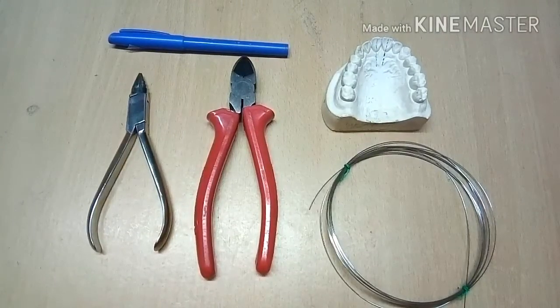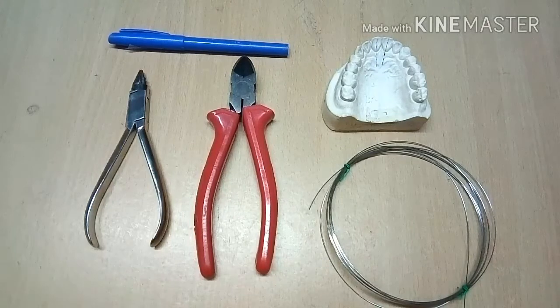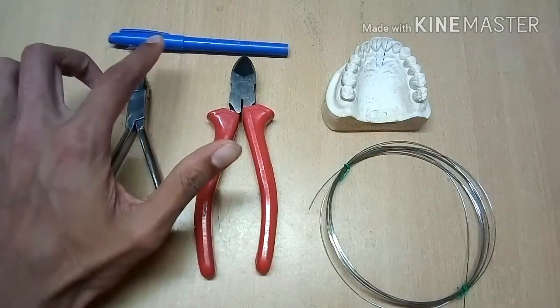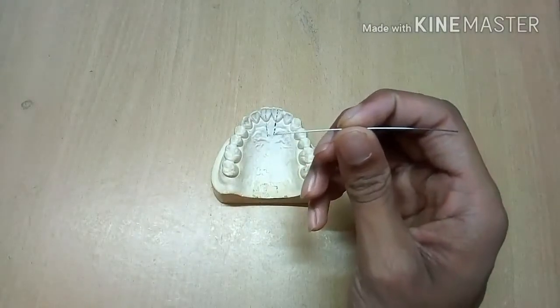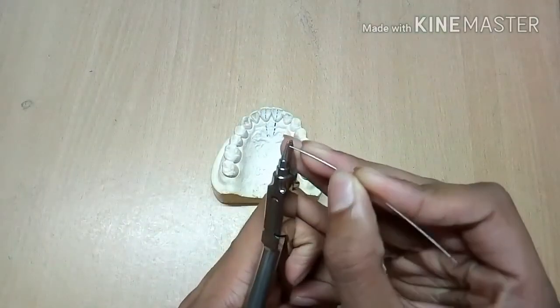For making a Zed Spring we require a young sloop plier, also called universal plier, heavy wire cutter, marker, cast, and 0.6 mm wire. First, take about a finger length of 0.6 mm wire and try to straighten it.